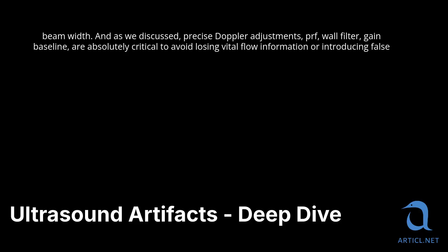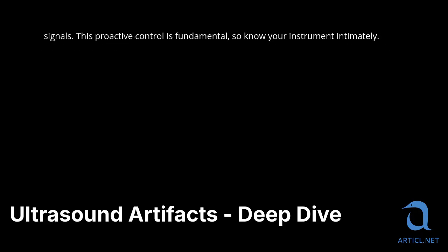And as we discussed, precise Doppler adjustments, PRF, wall filter, gain, baseline, are absolutely critical to avoid losing vital flow information or introducing false signals. This proactive control is fundamental. So know your instrument intimately.